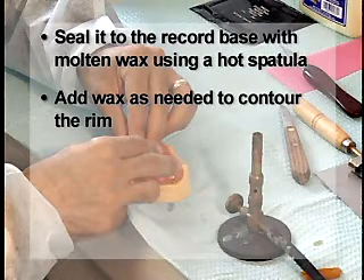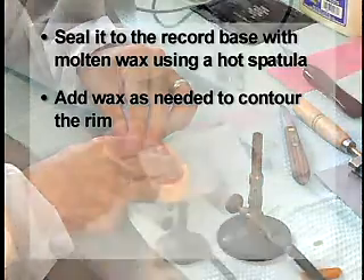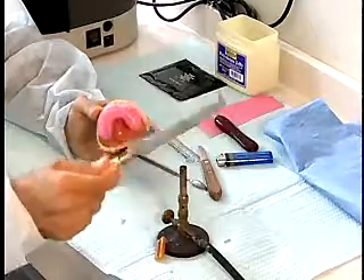Remember, the facial surfaces of the central incisors are 5 to 9 mm anterior to the center of the incisive papilla. Use a pancake turner or a heated wax spatula to develop a flat occlusal plane.